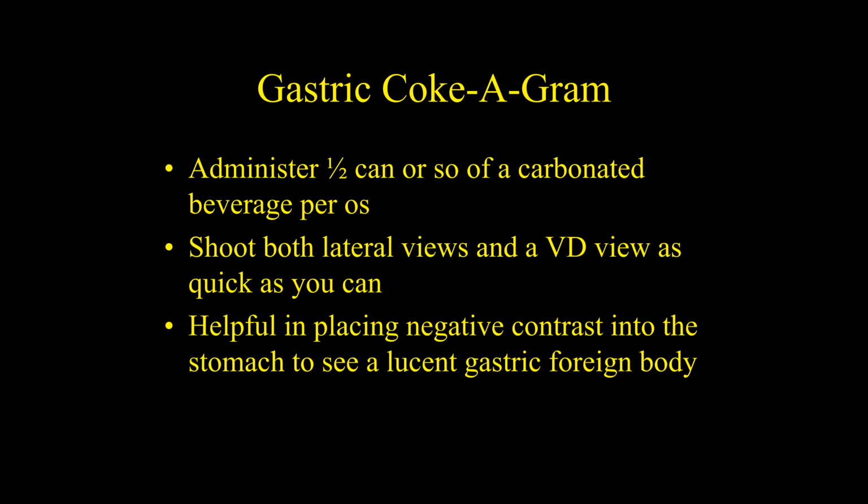The other thing that you can do to put gas in the stomach is you can pass a stomach tube, or you can just give by mouth in a syringe half of a Coca-Cola or a Sprite or a beer or whatever, some kind of carbonated beverage. The idea is that we want the animal to swallow a bunch of gas, okay? The dogs get that carbonated beverage in their mouth and it feels weird and they start even swallowing more gas.